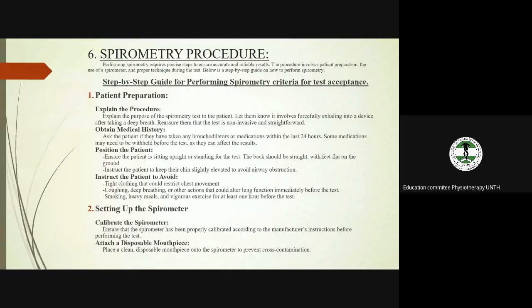Ensure the patient is sitting upright or standing for the test. You can sit, you can stand, and the back should be straight with feet flat on the ground. The patient should take a good posture while taking spirometry. Instruct the patient to keep their chin slightly elevated and avoid airway obstruction.